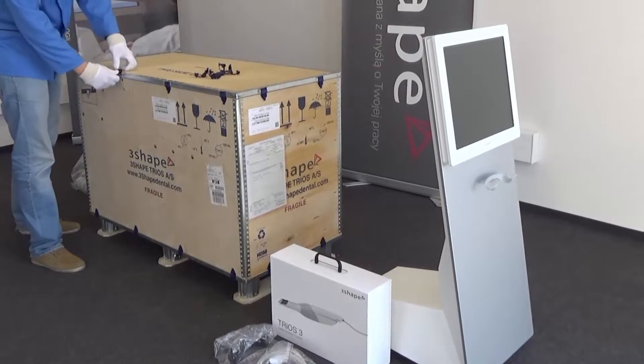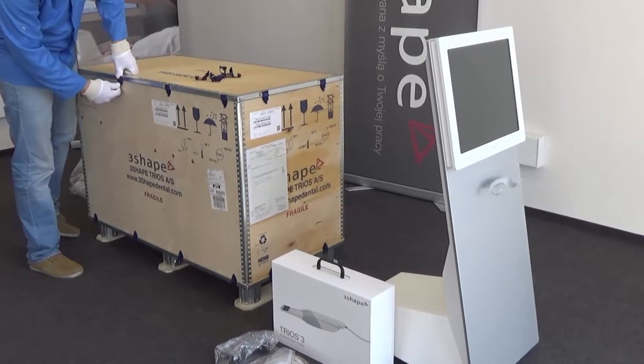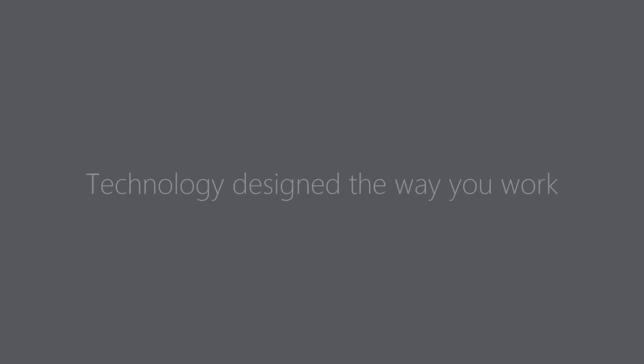The cart is an easy installed system, fully designed by 3Shape for the best Trios experience.